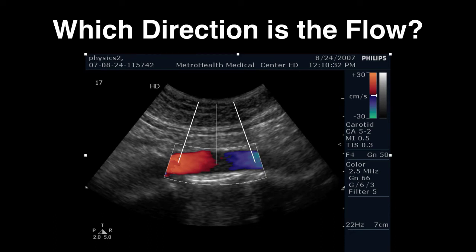Now some of you may be looking and going, wait a minute, you're in the carotid preset, so flow should be going this way towards the head. And I probably should have blacked out this box here, but actually we were not scanning the carotid here. We were actually scanning the femoral artery, so flow is going this way, because remember, anterior, posterior, head, foot, so flow will go this way, and that's what our color map depicts here. This concludes the color flow Doppler video.